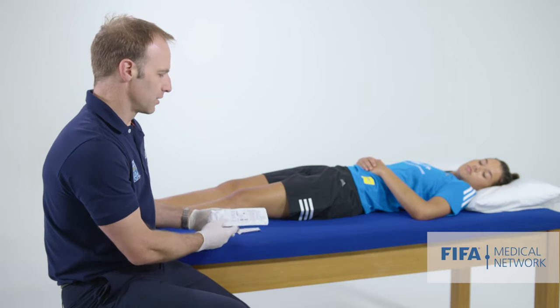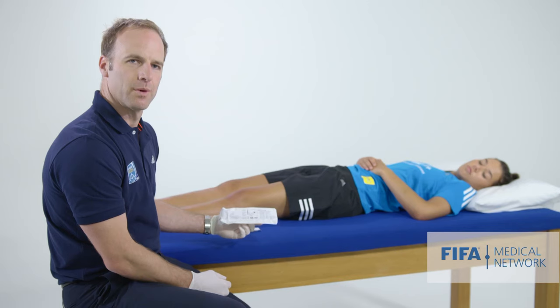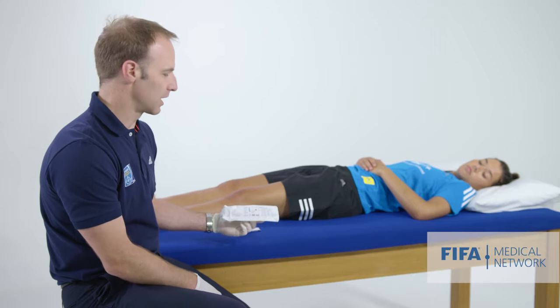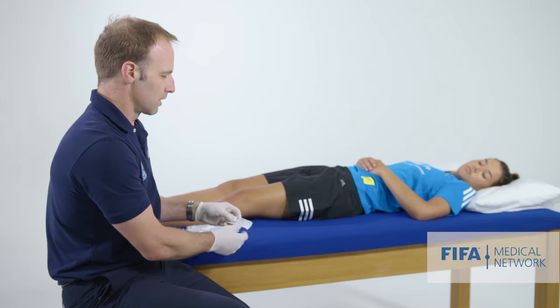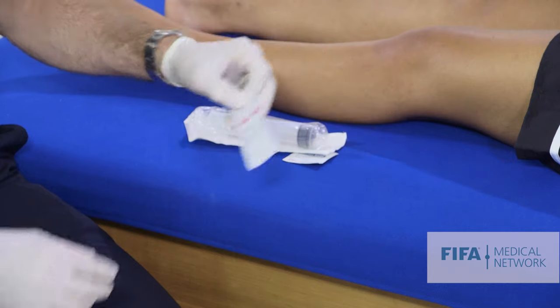To do this, you need to use the biggest syringe you can find. I like to use a 50ml syringe — I'm constantly surprised by how much blood and fluid we can aspirate from a knee, and anything smaller becomes tricky. We also want to use a fairly wide or large gauge needle; I like to use an 18 gauge needle.